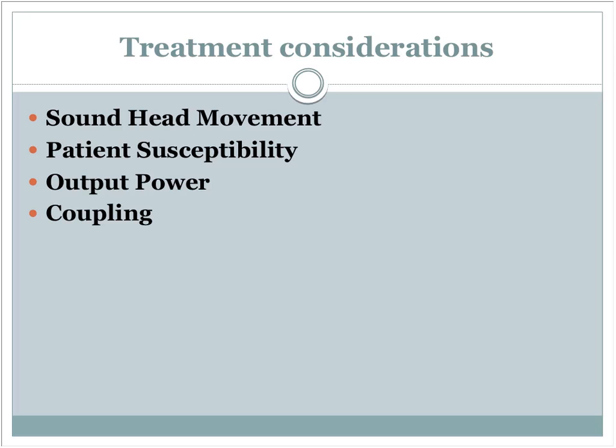Well, if you look at a period of time, and I'm not going to give you numbers for it, just a period of time, 1 megahertz is going to be, say, one of those waves in that period of time. 3 megahertz is going to be 3 waves in that same amount of time, okay?